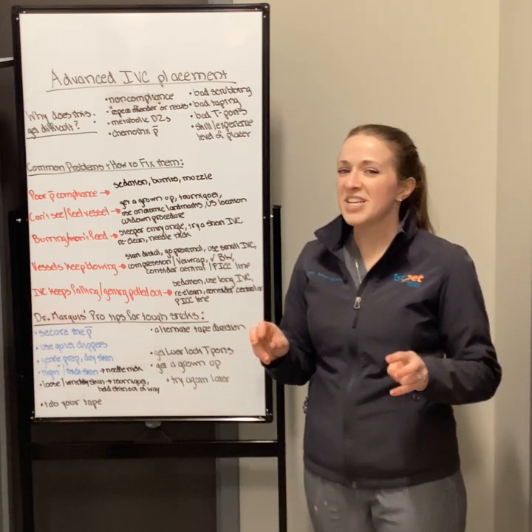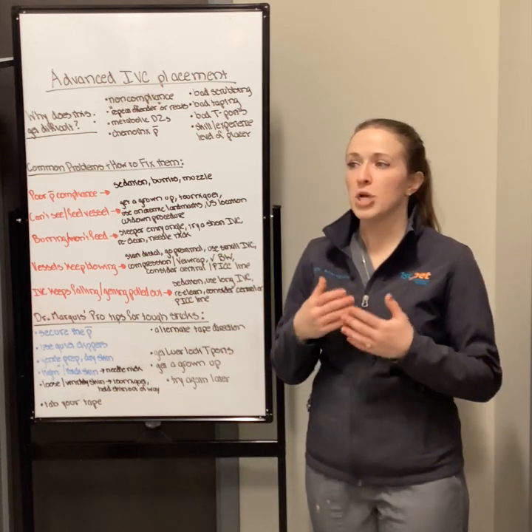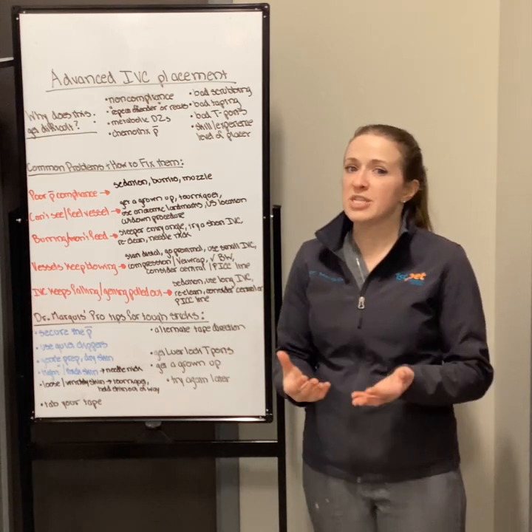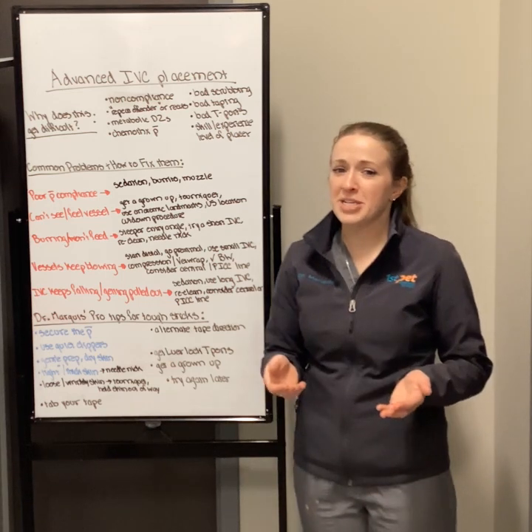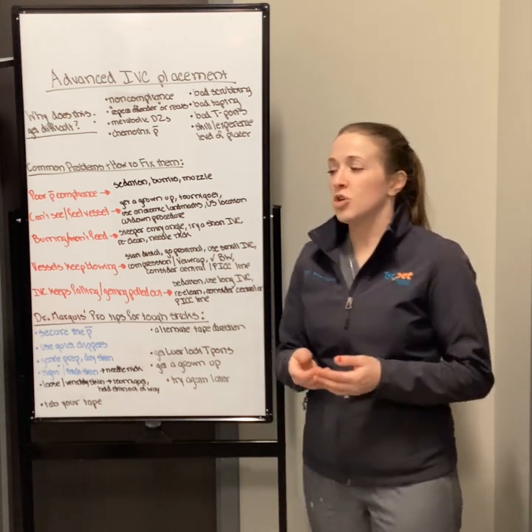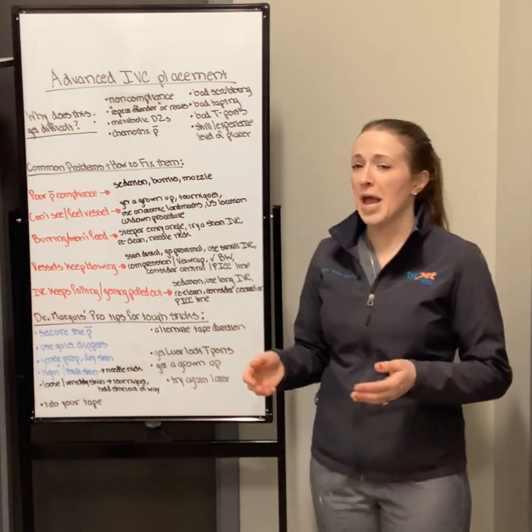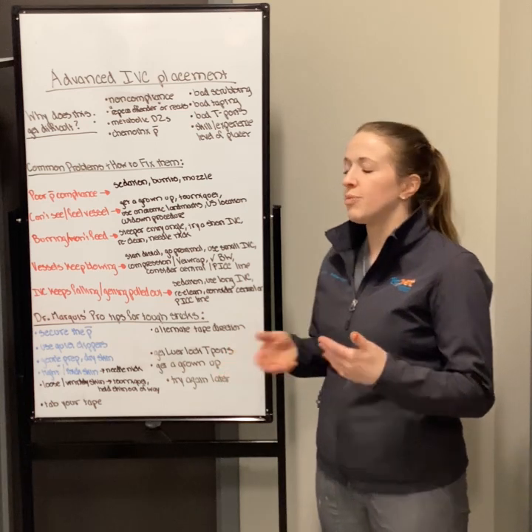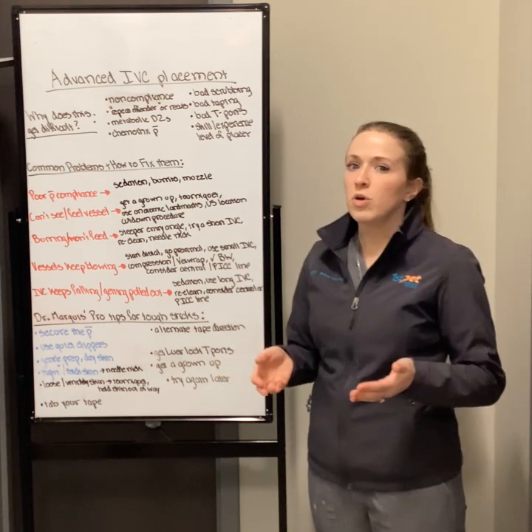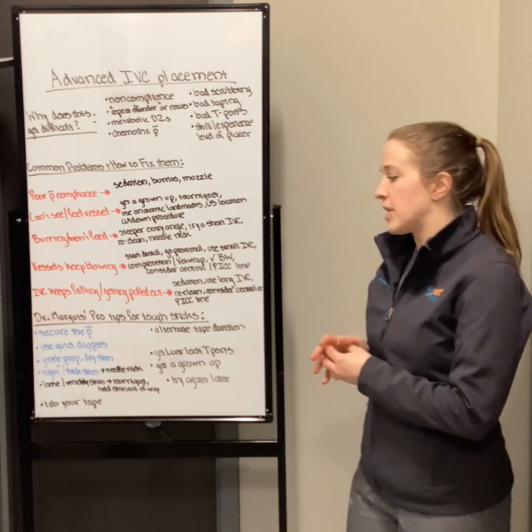Okay, the last thing I want to talk about are a couple of my pro tips for tough sticks. These are some general things that I do on the clinic floor, which I feel helps me be successful placing catheters. Even so, I'm not going to be successful 100% of the time, so I always try to incorporate other things like getting help, asking for advice. But these are just some things that I do. Obviously, this is going to depend on who you work with, where you work, what your style is, but hopefully you find these helpful.